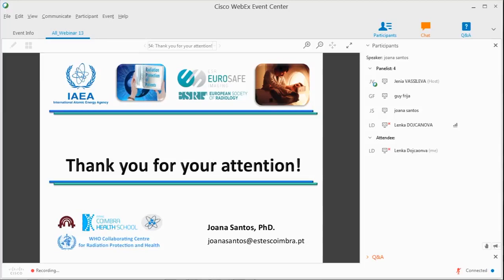You need to have at least 3 different types of professional. However, it's better if you could include more than one person for each professional group. None of these professionals should be left out of the optimization process. All of them are important, with their different tasks.